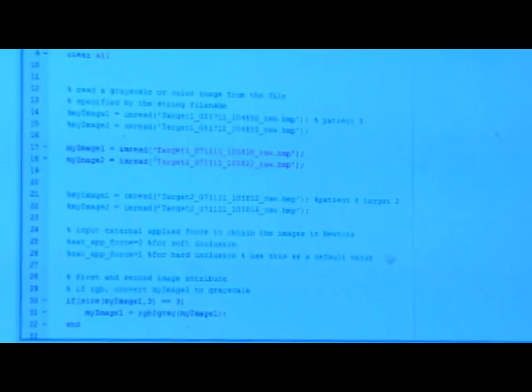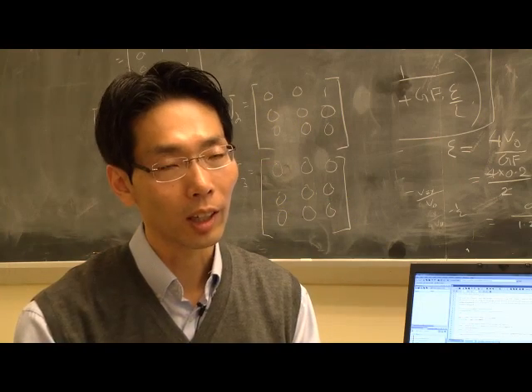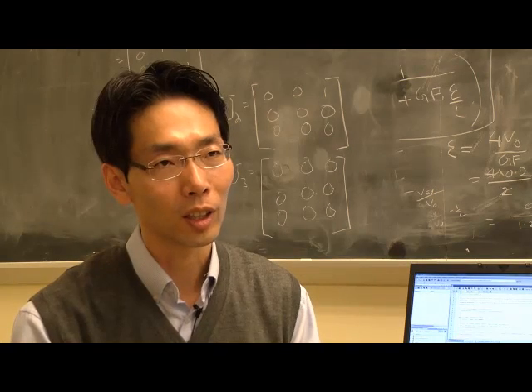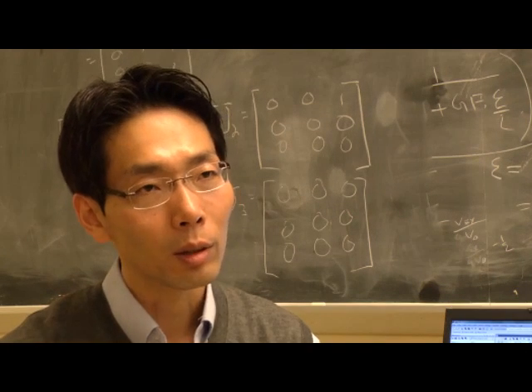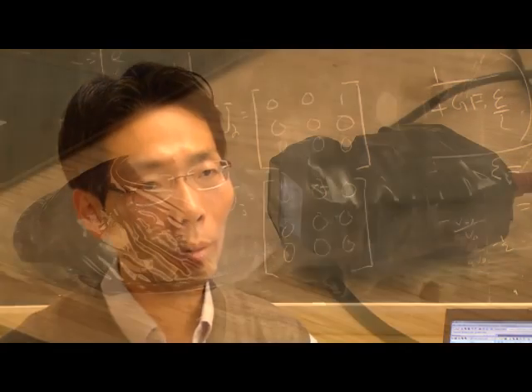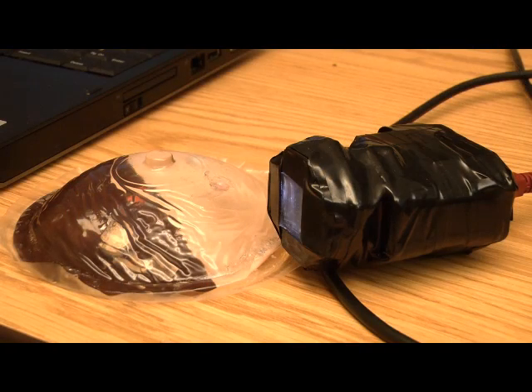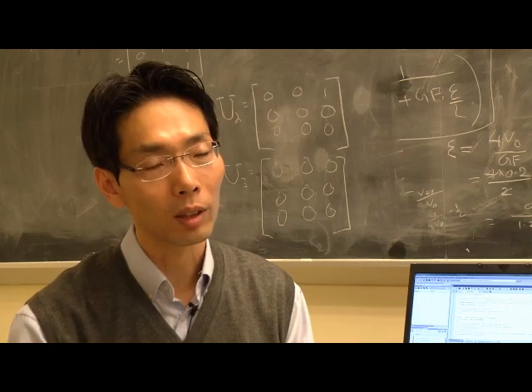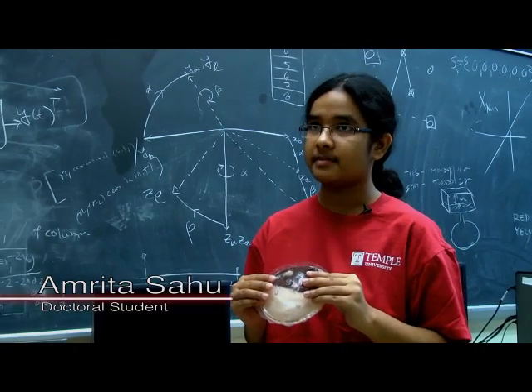One possible way is if a doctor does a clinical breast examination and finds there is a lump, he has to make the decision whether to send this patient to the larger hospital for a mammogram and biopsy, or they could decide to get help from this device and see what the probability of this becoming malignant is to make the decision. This is the Mammacare Phantom.